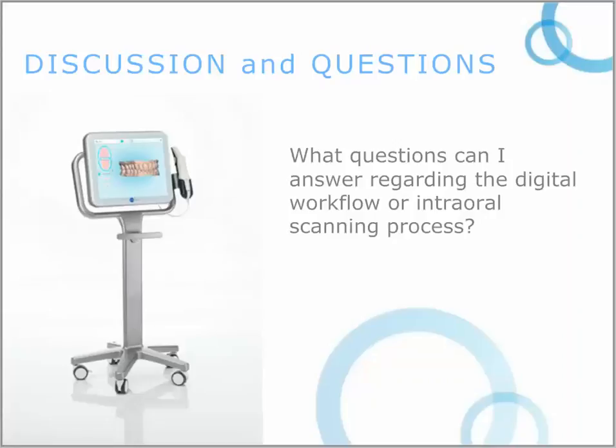My 3D printers were industrial printers that I used to develop and understand and find what worked in dentistry. I have a Stratasys printer, an Envision Tech Factory 4 printer, and a Form 1 printer. Those are printers that we've had to learn to use, but they are not specifically built and made for dentistry. I think you will see that come in the future, but we're not quite there as yet. The mill, we can make the case for milling and digital scanning is a nice mix.